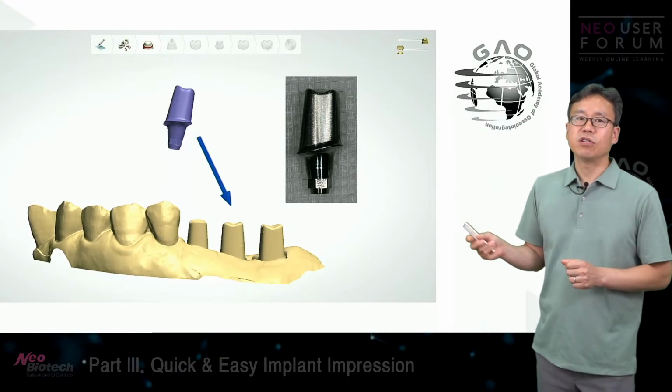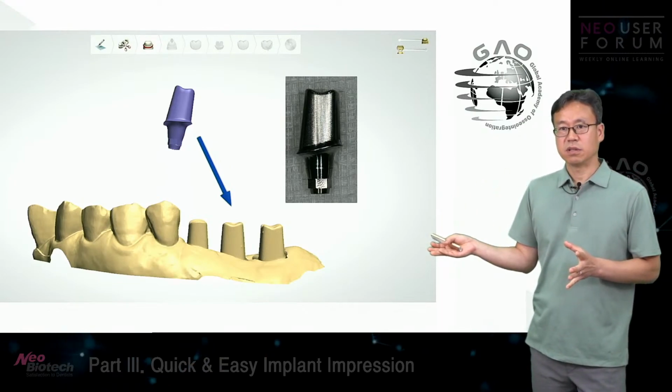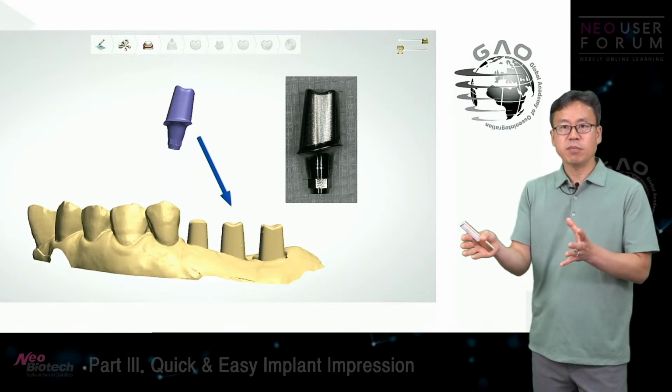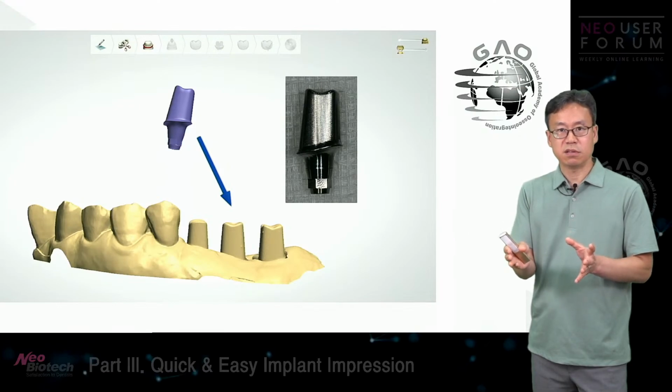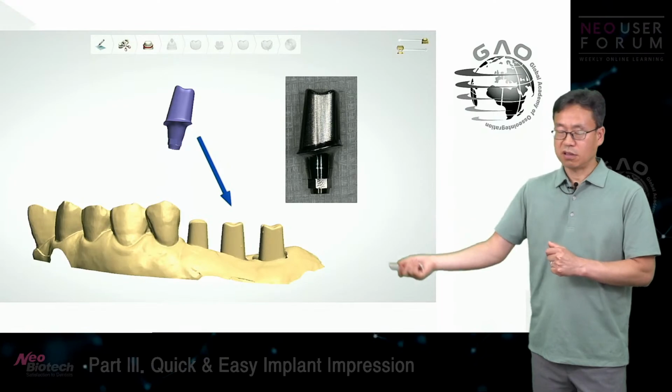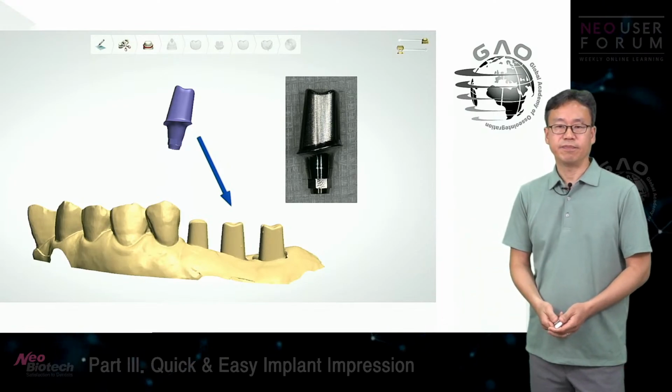This procedure is essential because you want to verify if the abutments are properly milled according to the CAD design.